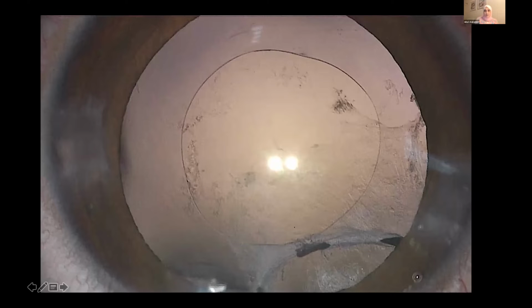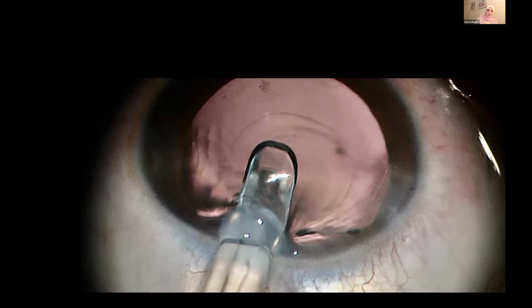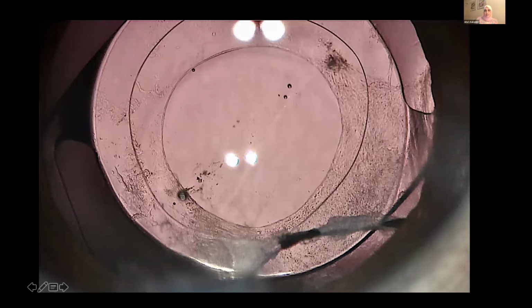Here, after irrigation aspiration, you see this is the anterior rhexis, and this is a defect. We have to leave a hinge or a fibrous band. We don't make them continuous with each other. And then we continue with the posterior rhexis. Here with magnification, you see this fibrous bridge between the anterior rhexis and the defect. Why? In order to inject the intraocular lens inside the capsular bag. You see here the IOL beautifully placed, and you have partial fibrosis of the posterior capsule. And this is the bridge between the anterior rhexis and the anterior capsular defect.